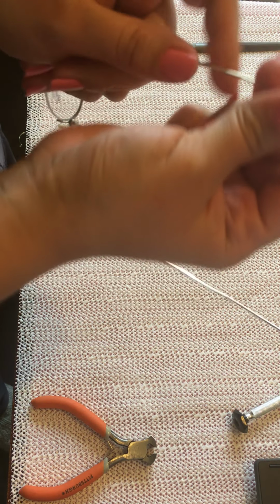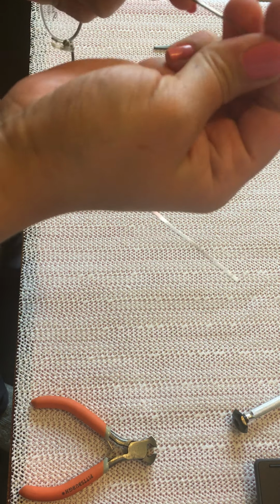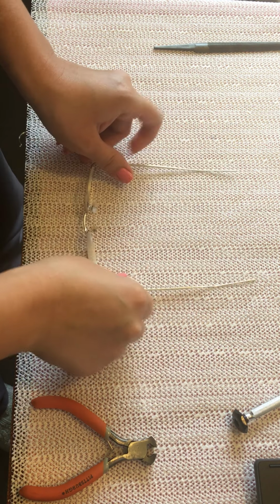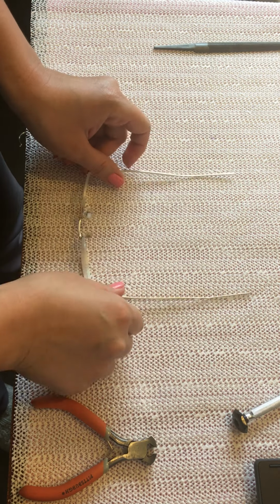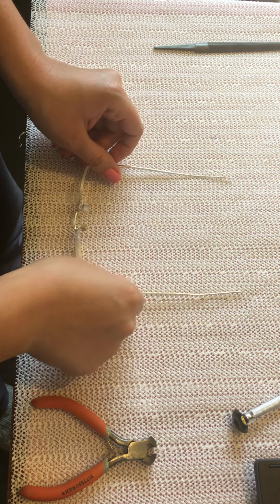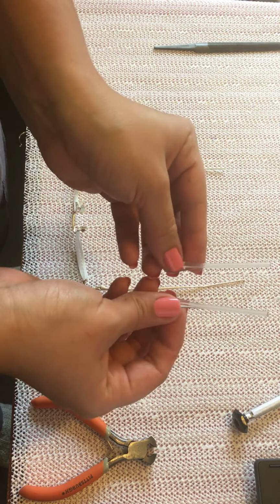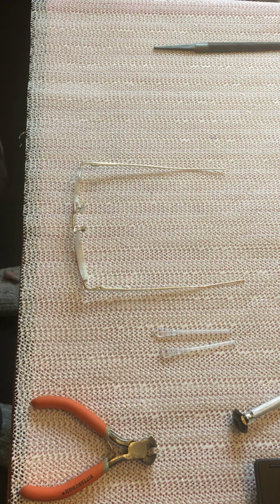On this side, I am going to straighten it as well. So it should have already been straight. Now when we have both of our temple ends straight, we get the new temple tips, which are these. And we're going to do one by one.